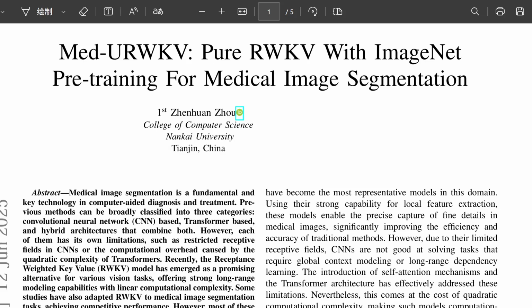For a long time, the go-to was convolutional neural networks, CNNs, especially the UNet. UNet, yeah, a real classic for segmentation. What made CNNs like UNet the standard for so long? Well, they're really good at picking up local details, fine textures, sharp boundaries. CNNs work by looking at small patches, finding patterns there. For segmentation, that's vital. Okay, so great for the close-up view, but what was the downside?